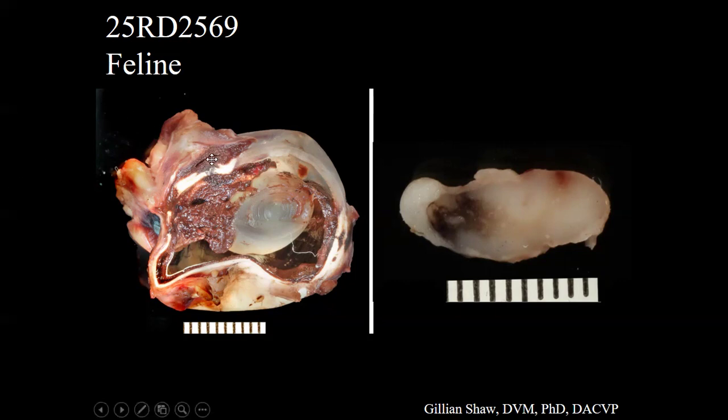But what we can make out is that there's a brown mass affecting the ciliary body, probably the iris, and it's also in the episclera right here, and perhaps going through the sclera at this point right here. There's also some brown stuff around the back of the eye, maybe in the episclera and other areas. So there's a brown tumor that's pretty extensive here. And then the lymph node, which has been hemisected, somebody took a lovely picture of it, has this area where there's a lot of brown stuff. So right off the bat, we have a melanocytic tumor with concern for metastasis to the lymph node.